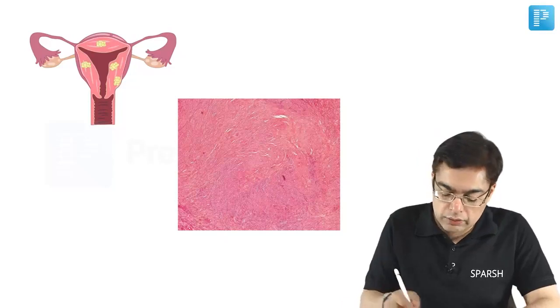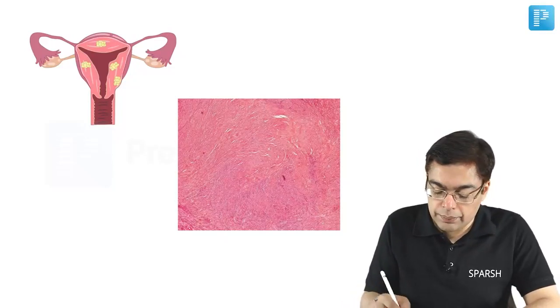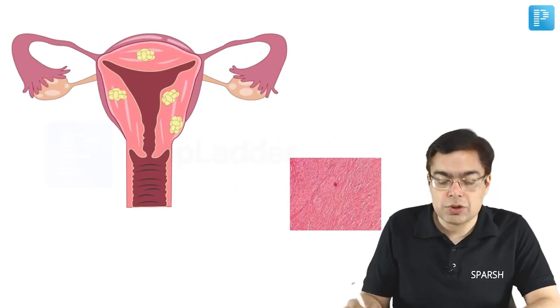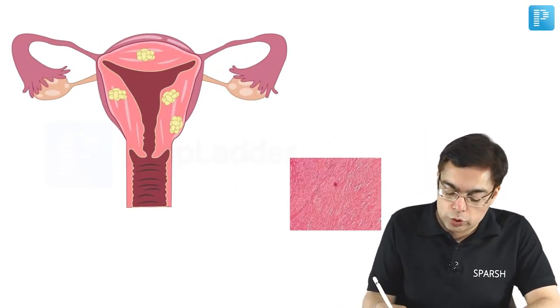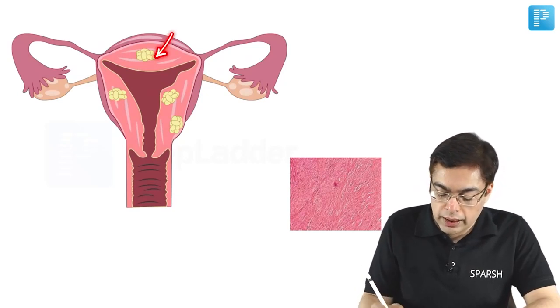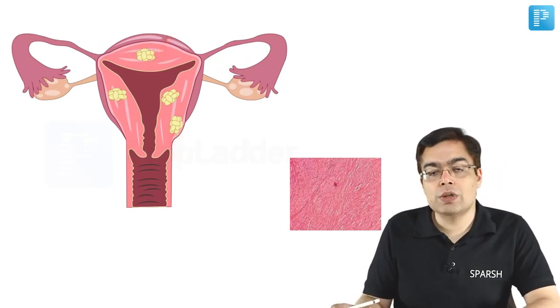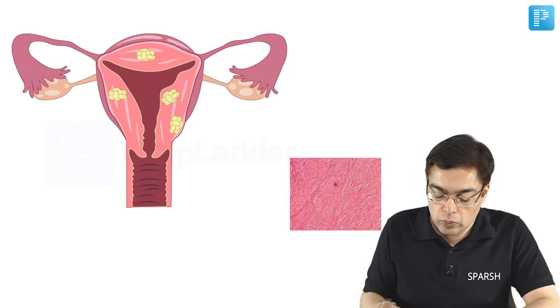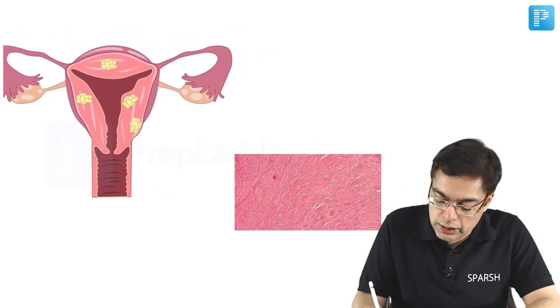Now talking about our discussion of the important images, relatively important ones from the context of the female genital tract, we will be talking about an example of a mass that is going to be composed of smooth muscle cells, which could be an example of a mass which is going to be either intramural, subserosal, submucosal, associated with presentation in the form of heavy bleeding or for that matter reduced fertility in case of a young female.